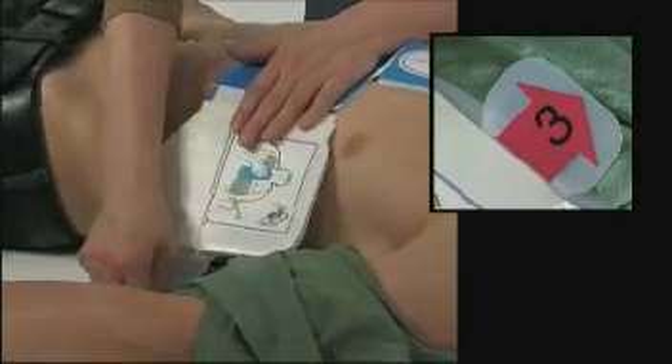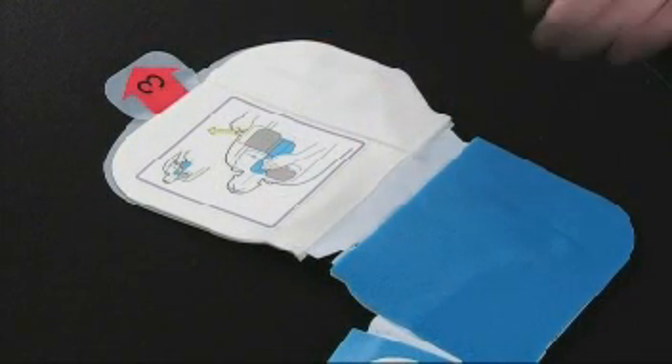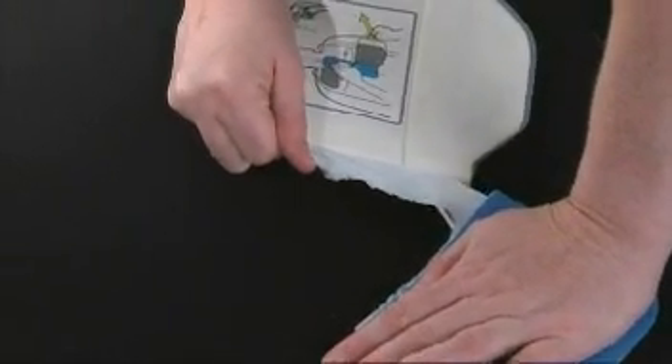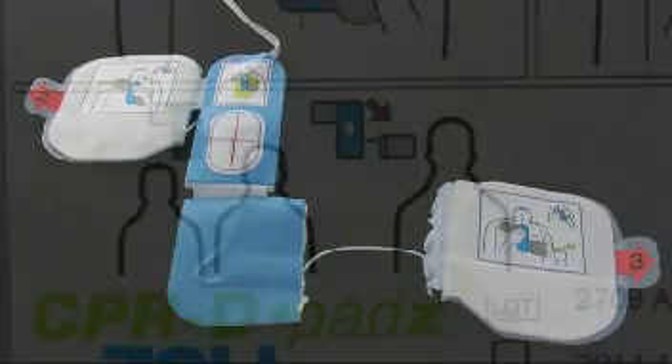Repeat the action on the lower pad, marked with the number 3 tab. If the patient is large, you will need to tear away the lower pad at the perforated line and extend it before pulling the number 3 tab. The pad should be placed on the side chest wall, in line with the left armpit.